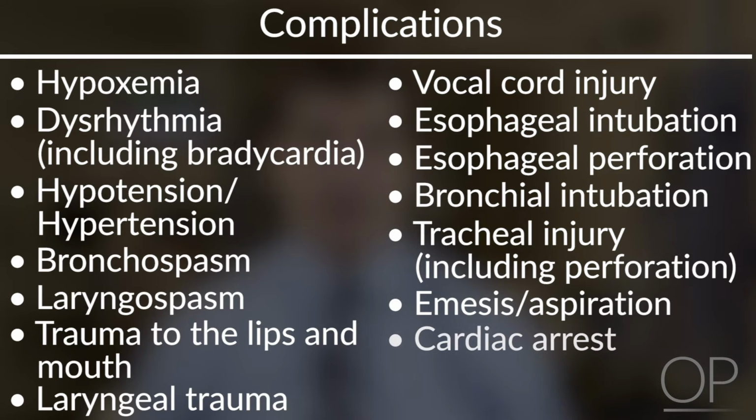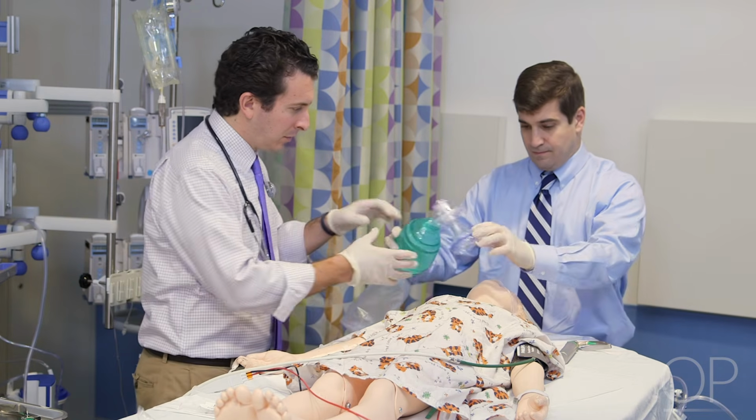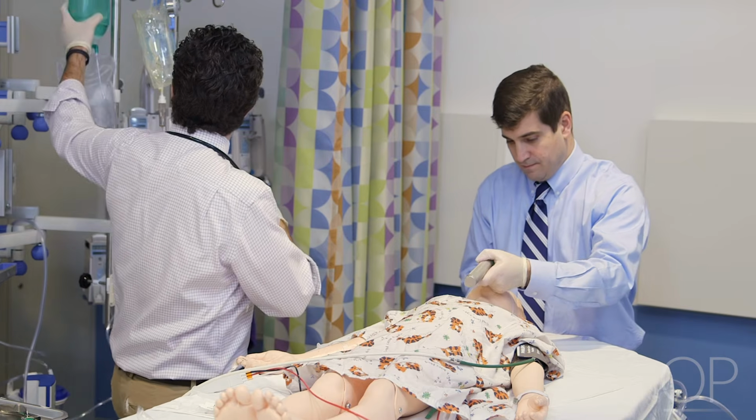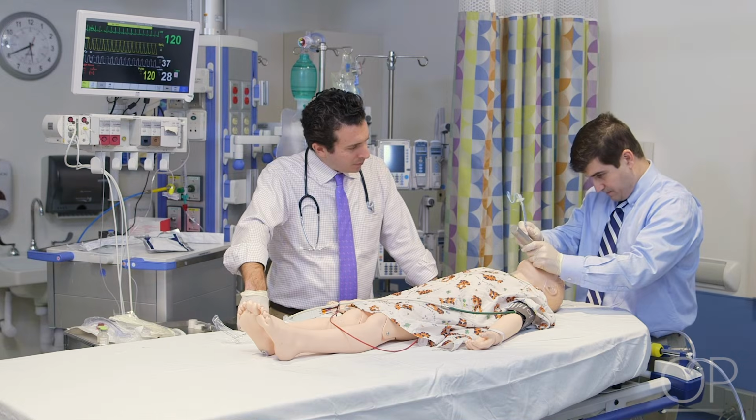A clearly defined intubation plan prior to the procedure should include strategies for optimizing attempts as well as responding to unanticipated difficulties. This preparation can be helpful in avoiding potential complications. During the procedure, providers should take care during insertion of the intubation equipment and avoid undue pressure on the fragile tissues of the airway.